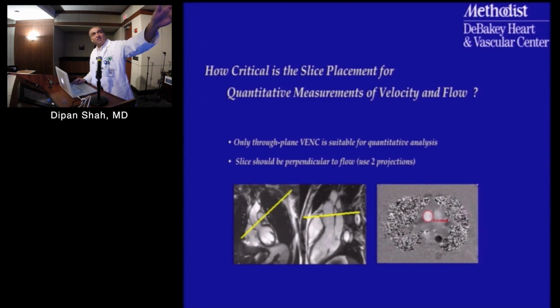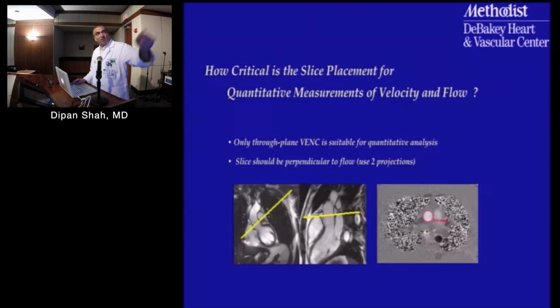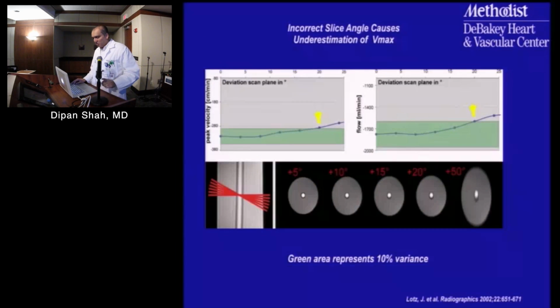What it will give me is not just one image, but a series of images at slightly different points in the cardiac cycle, because this is actually a movie that we're doing, and I'll come back to this in a second. But let me show you the angle that you utilize. Is there importance to the angle? So obviously, what happens if you're off axis? The more off axis you become, the more potential error you could have.